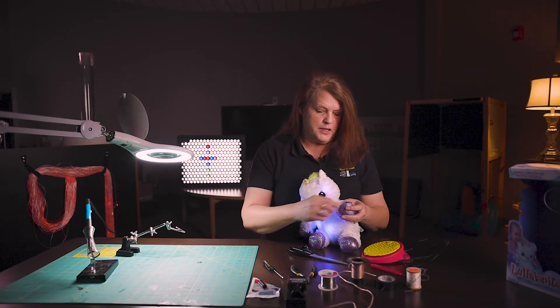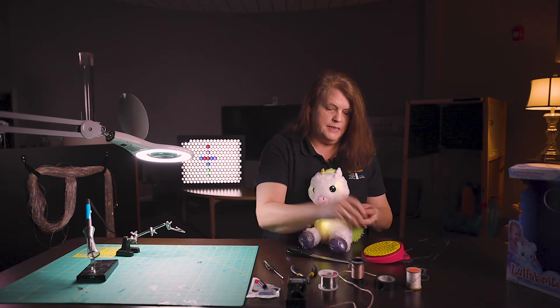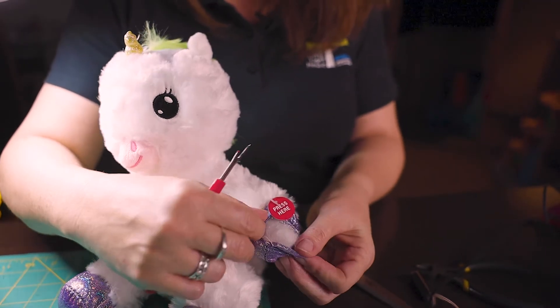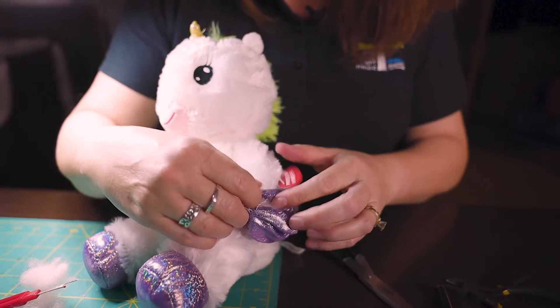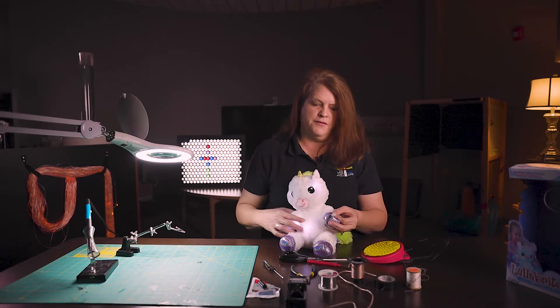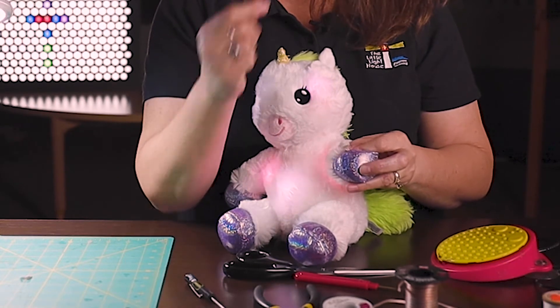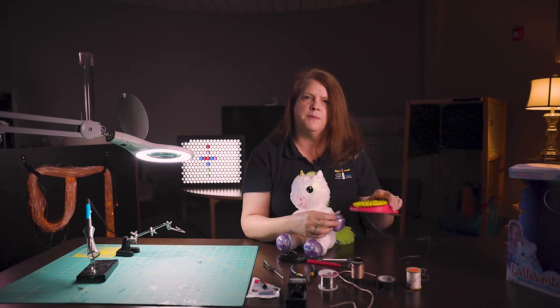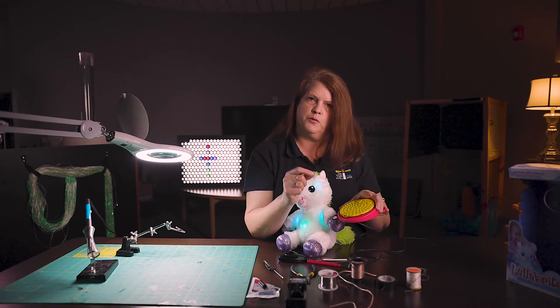This switch was already placed within the toy's hand. We used a seam ripper and tore up those seams, then pulled out some of the stuffing to get in there and see what was making the toy activate. You can see that's a really small switch, which would require a child to have good fine motor skills to pinch. What we're going to do is use a larger switch so the child doesn't have to use those fine motor movements.